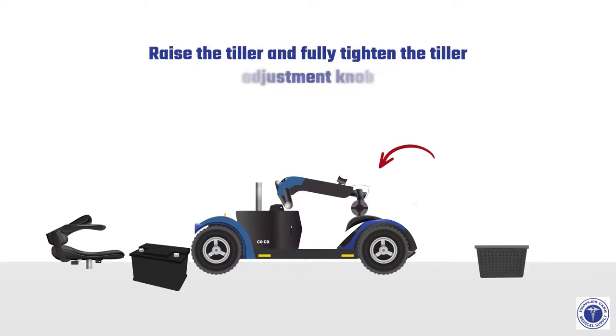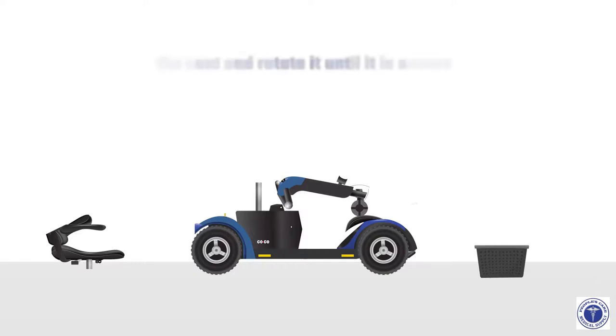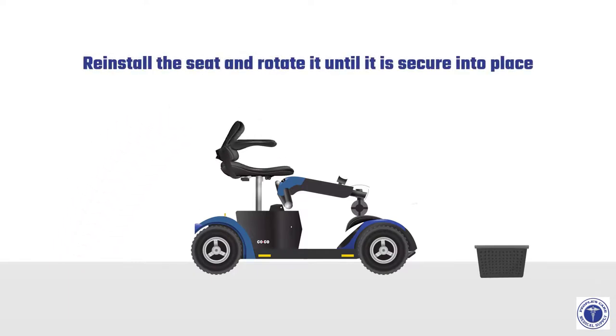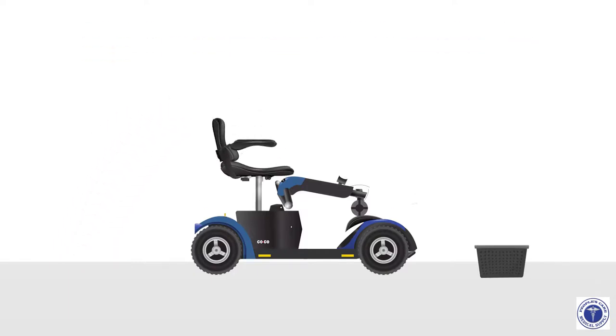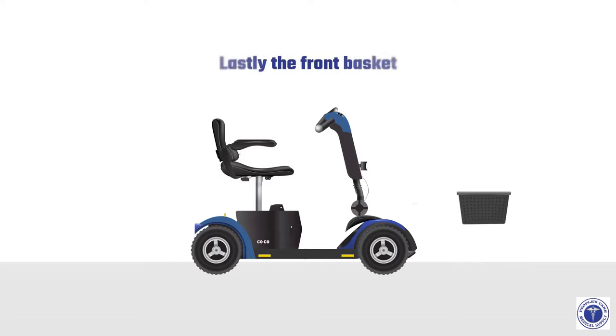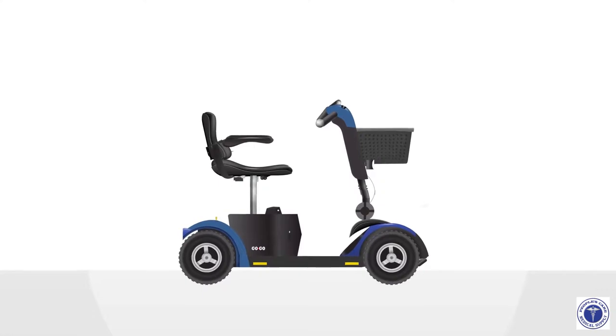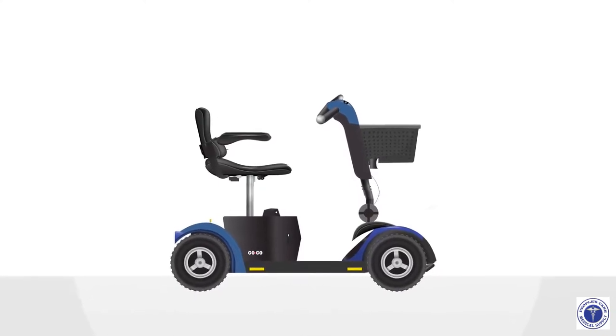Raise the tiller and fully tighten the tiller adjustment knob. Reinstall the battery pack, then reinstall the seat and rotate it until it is secure into place. Unlock the tiller by turning the tiller lock knob 90 degrees counterclockwise. Finally, reattach the front basket. That completes how to disassemble and assemble the GoGo Sport Travel Mobility Scooter.